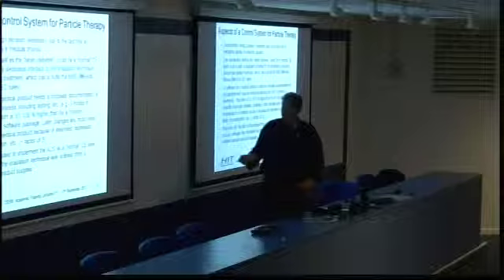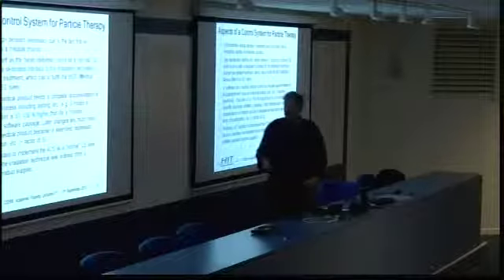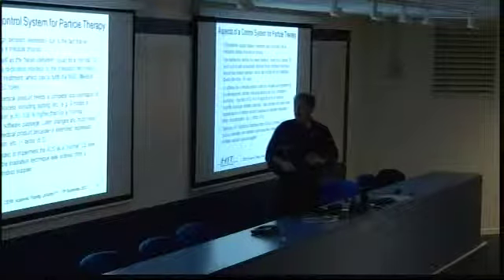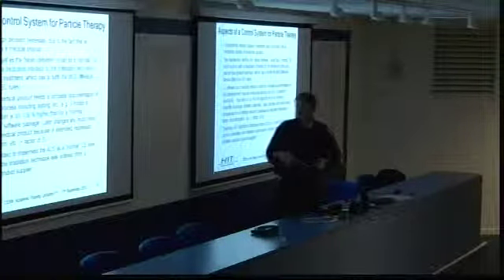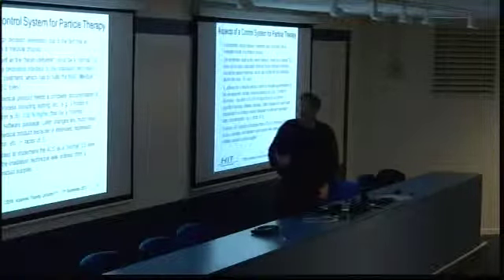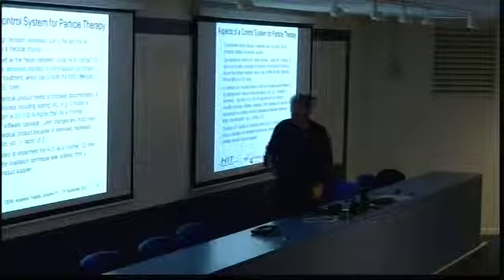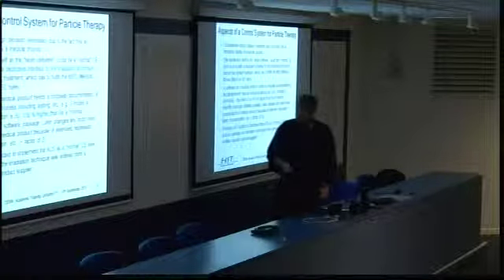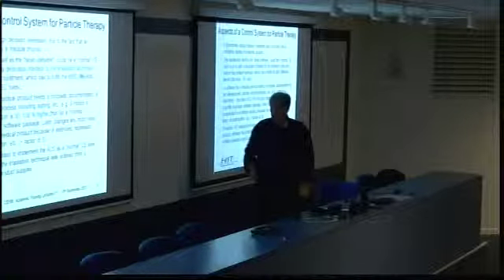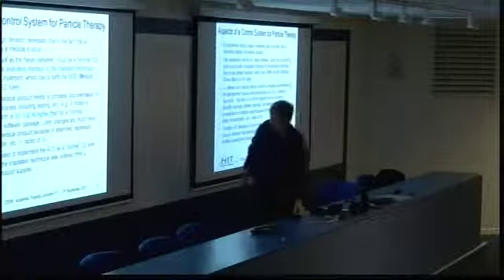Especially if you want to have changes later on, then the effort is a factor of 3 larger than for a normal product, because you have to do all these regression tests, and you have to do a lot of documentation and everything. So software for medical products is very cost intensive. Therefore, we have given the contract for the accelerator control system to an automation supplier, and the medical product was done by Siemens, who is a certified medical product supplier.